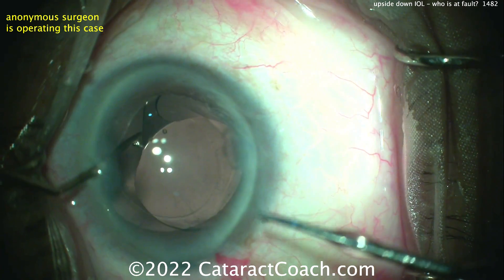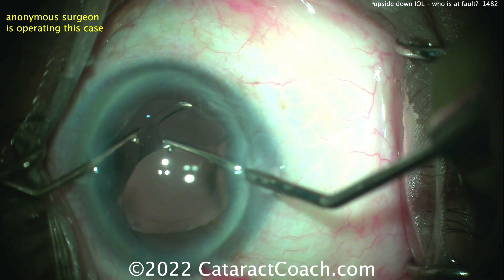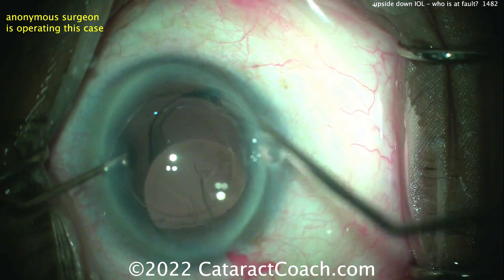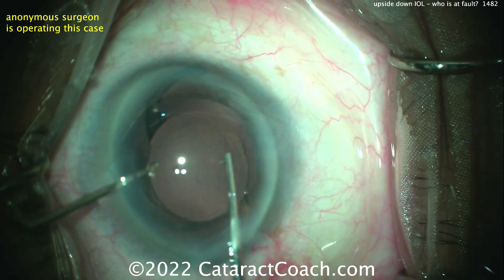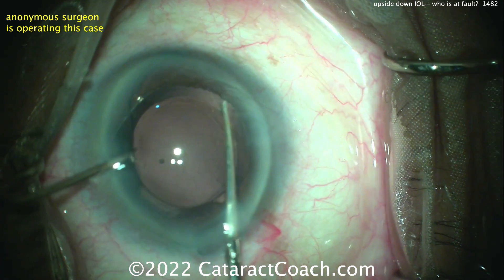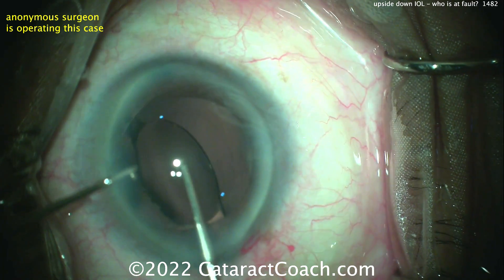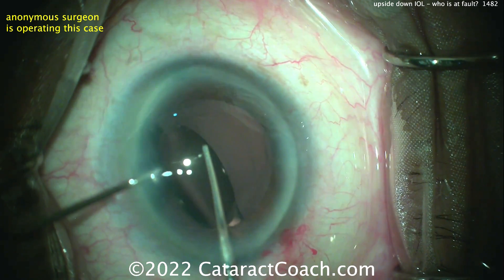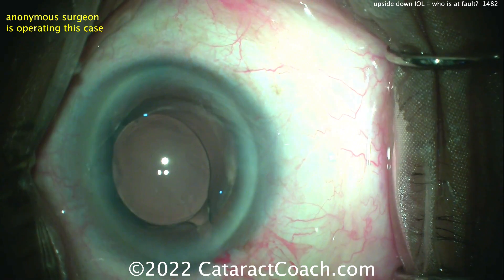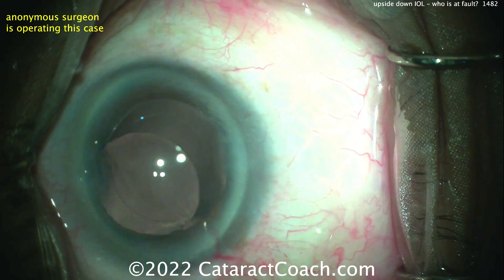Plenty of viscoelastic — my advice again is to pull one haptic out of the eye, as it's much easier to flip that way. The leading haptic that's in the eye backwards needs to be pulled out of the bag first — good move, I like that. Now you can flip it with more ease. Use two instruments to help flip the optic, and with one haptic still outside the eye that's helpful. Use as much viscoelastic as you need.